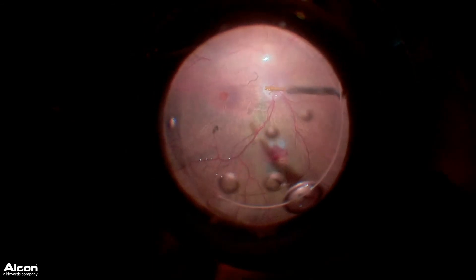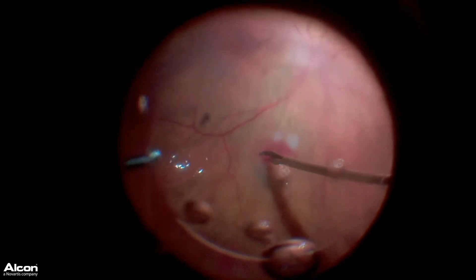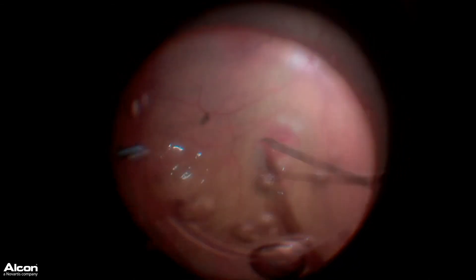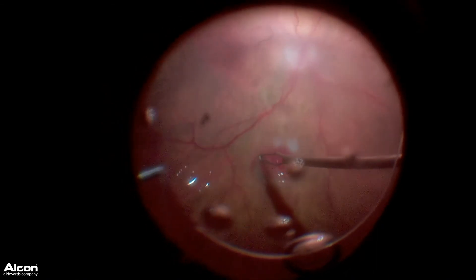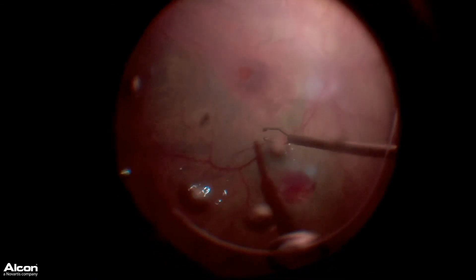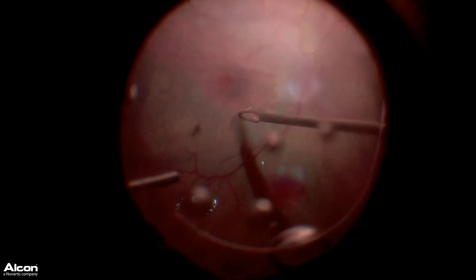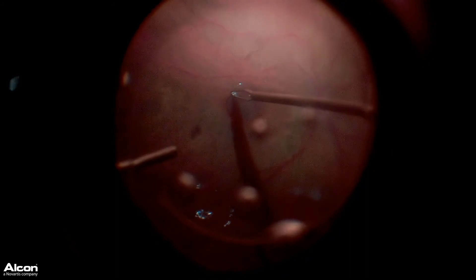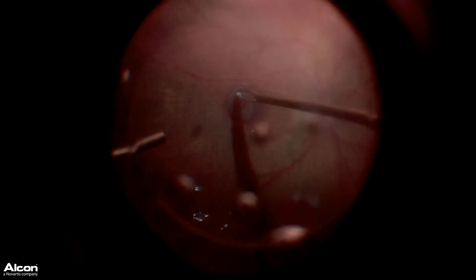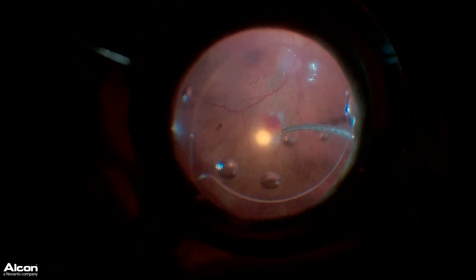We want to keep that transplant oriented so that the anterior side — the inner retina — stays on the inner part, because we're simply going to drag it over and place it over our macular hole. I'm completing the dissection of the retinal transplant with my scissors and utilizing my end-grasping forceps to pull this transplant under the PFO over to the macular area. Utilizing a chandelier and my light pipe, you can see it just covers that macular hole nicely with a little rim of about 100 microns or so on each side.